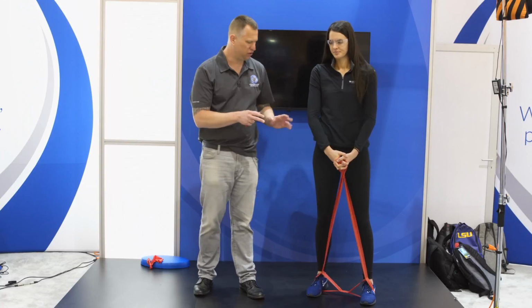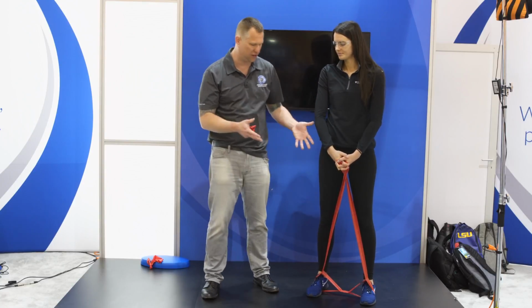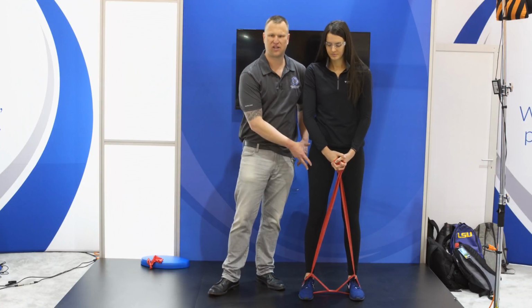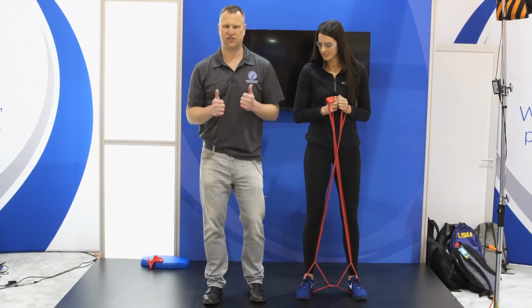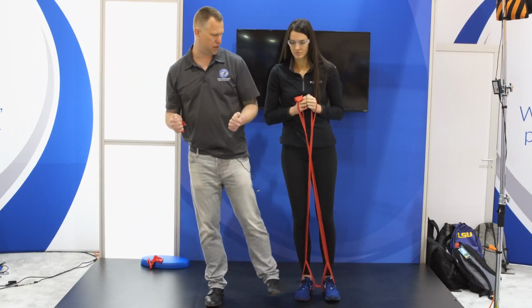They're telling you they're hurting actually in dynamic issues, functional issues, okay? So let's take, in this case, our client in that functional position. So now we can go in standing. We set the CLX in the same way. For the purpose of our discussion today, we're looking at right hip, knee stability. So I could simply, in this position, have her stand and just load onto that affected side, the right side, and just go ahead now and abduct with that left leg.